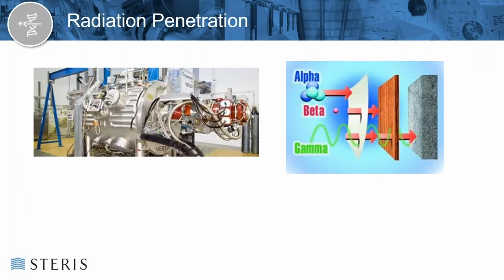Okay, so a picture or two here, just to get you an idea. What you see on the left here is an industrial electron beam. They come from a variety of manufacturers. The machine sizes vary greatly depending upon the power and the purpose. There's many machine designs with different modes of action to provide for high energy accelerated electrons. Users need to choose the machine design that suits their intended purpose. But a lot of our machines are rather large, like the one you see in this picture here. Some are a bit smaller.